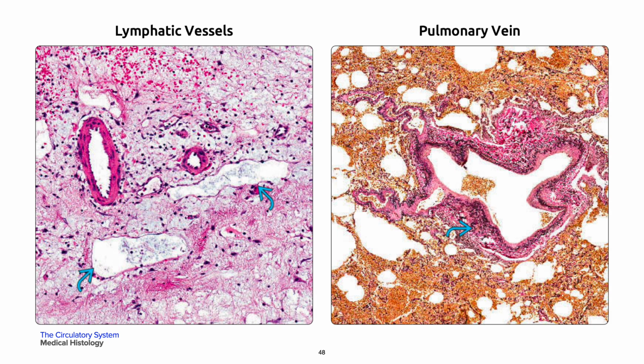On your right is the veins in the lung that are recognized by the absence of an accompanying airway. No internal elastic lamina is seen here. The adventitial elastic fibers in a curved blue arrow are coarse and poorly organized.